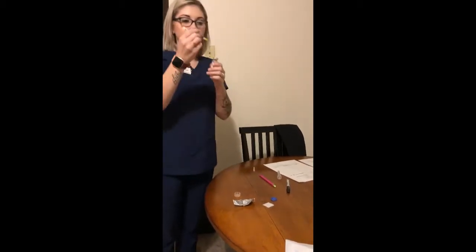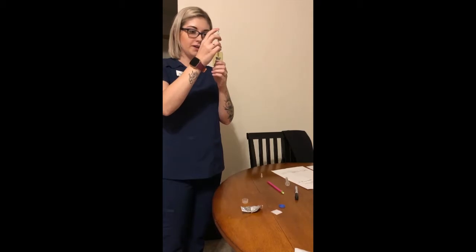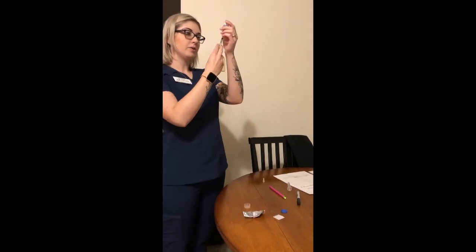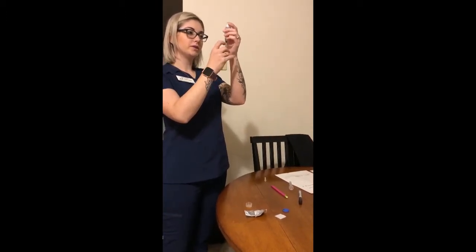And then you want to inject it at an angle. Then you want to put the air in, flip it to 90 degrees, and pull out 0.1 milliliters.